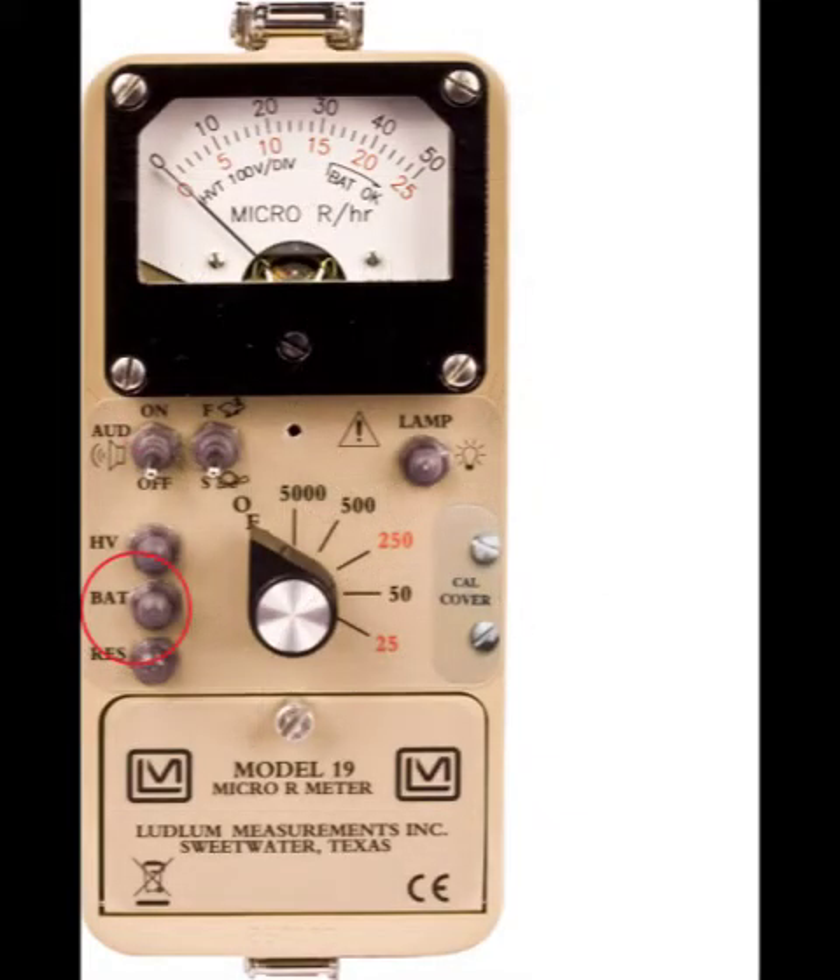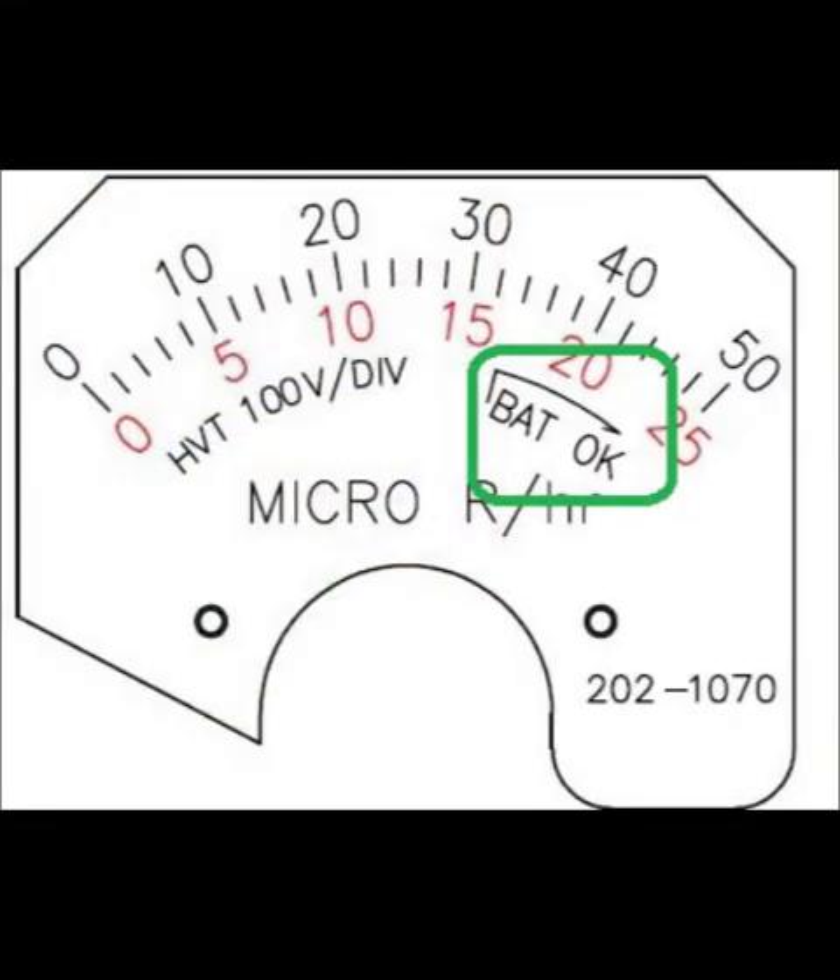The BAT button will show the current power level of the batteries when pressed. To use this, turn the instrument to any range other than off, then press the BAT button. Ensure the needle falls within the BAT OK section of the meter dial. If it is below this, the batteries need to be changed.